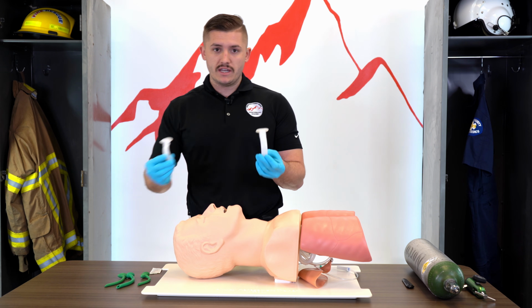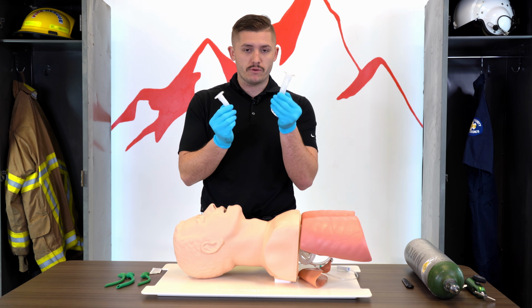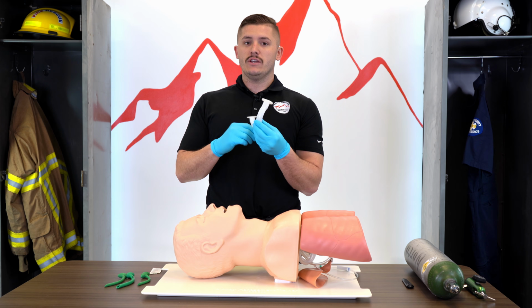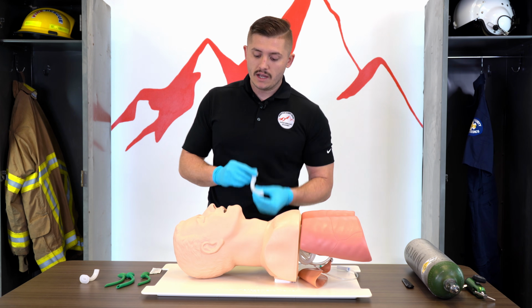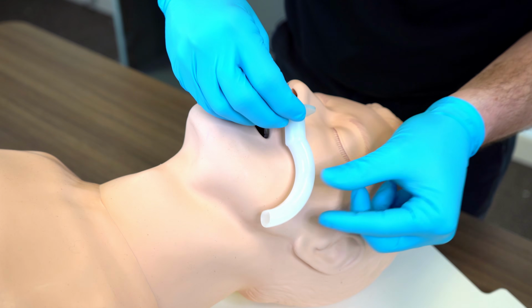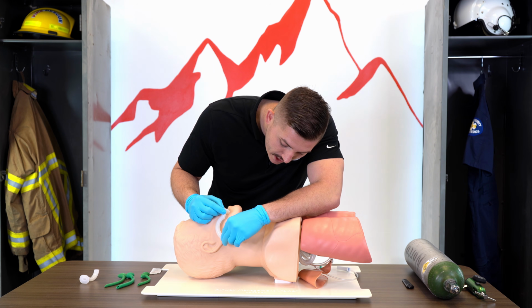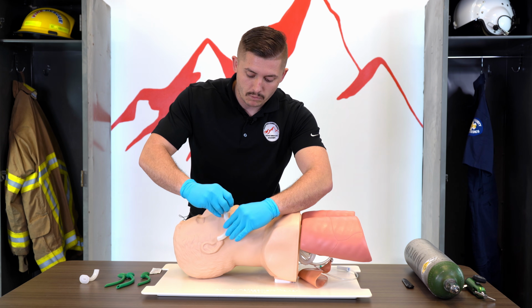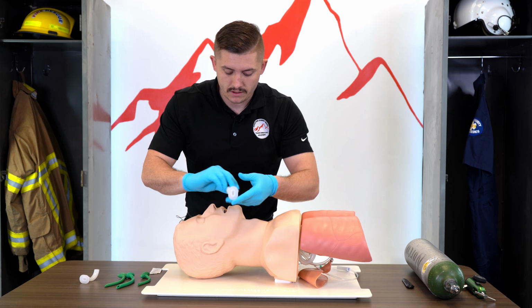These do, as you can see, come in multiple sizes, so you have to choose the best size and measure before you place it in the patient's airway. If you use an incorrect size adjunct, you're actually not helping your patient at all. So I'm going to take this one, I'm going to measure it. When measuring for an OPA, I'm going to go from the corner of the mouth to the bottom of the ear. This one might be just a tad small, or actually it looks perfect. This one's going to be good for our patient. It doesn't matter what way I measure it, the OPA stays the same length.